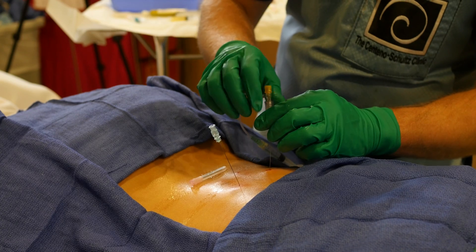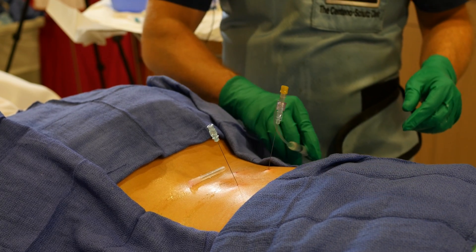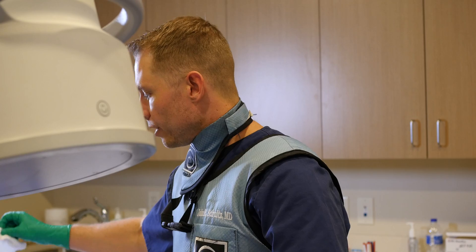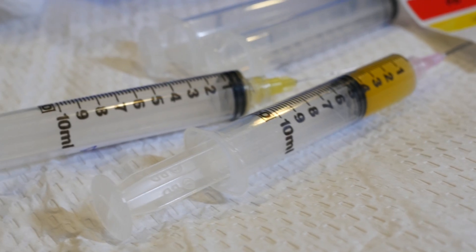I confirmed with the contrast that I was intra-articular. Then I put a very small dose of steroid, a very small amount of local anesthetic to give her some comfort, as well as a high dose of platelet concentrations. We actually use a nanogram dose of steroids — it's more of a physiological dose. The large steroids used in hospitals are in the milligram range. A milligram versus a nanogram are a million times different — that shows you how different this approach is.